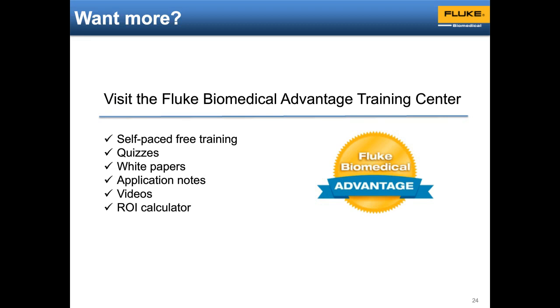Great. And now I'm just looking at all the reader questions. Someone asked about a non-standard R curve in a measurable way. They have a Spacelab SpO2 algorithm. So some of the manufacturers embed other manufacturers' technology. Manufacturers such as Nonin and others are embedded in larger patient monitors. The key is to understand from the monitor manufacturer which technology they're using so that we can get to which R curve. You have to match the sensor to the R curve very specifically, or you'll get an inaccurate measurement.